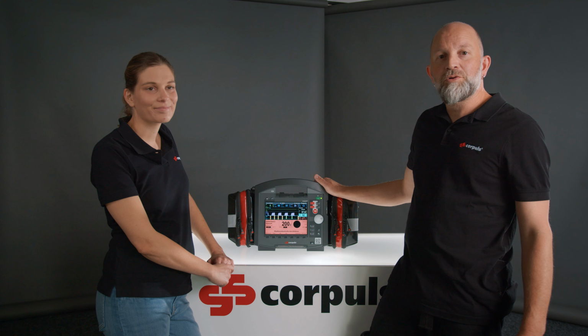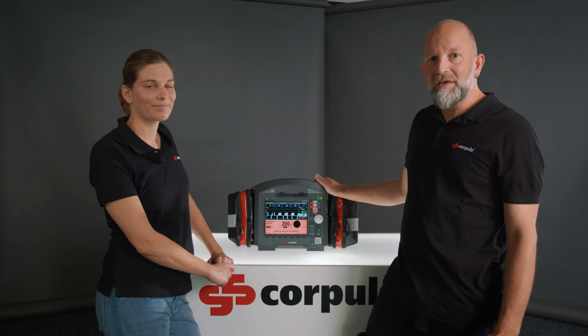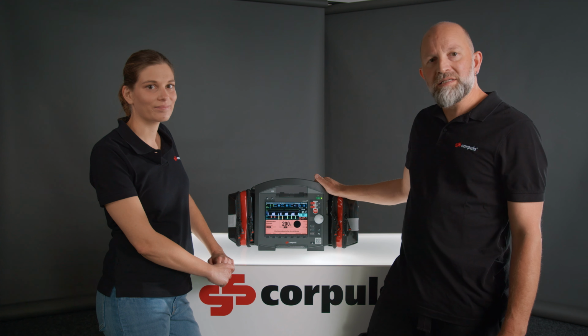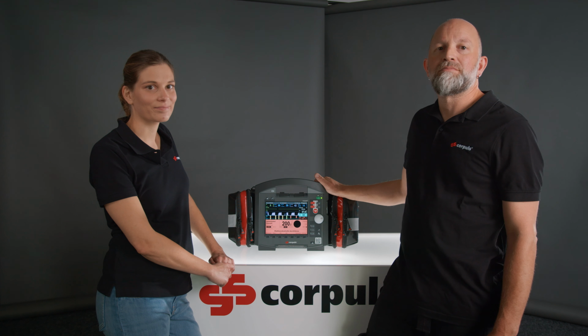We also have an innovation in manual mode. If we have previously selected auto sync or sync and the charging energy has been reached, we will receive a message that we should press and hold the shock button to deliver energy.